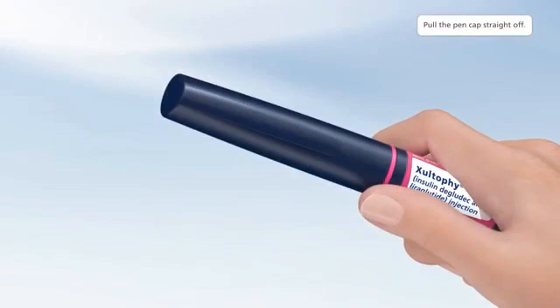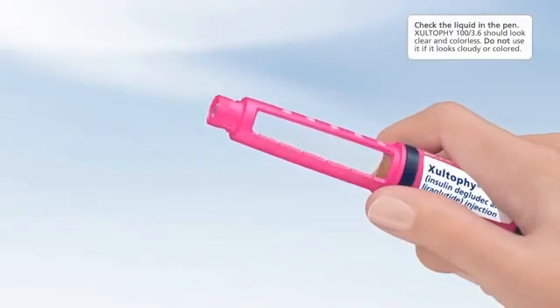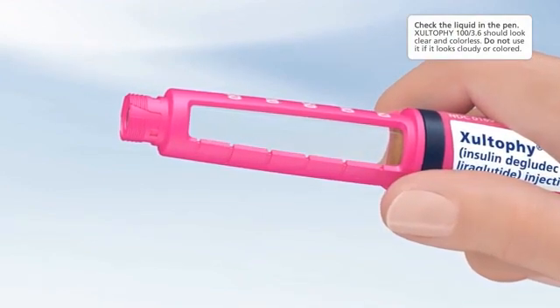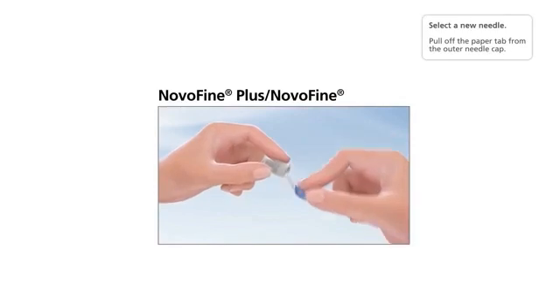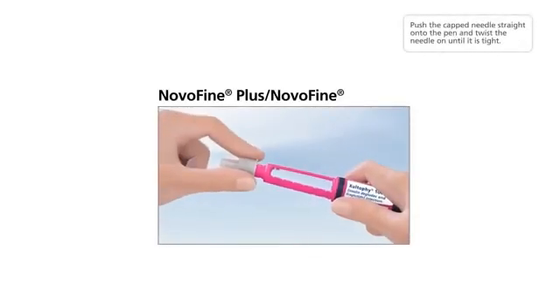Pull the pen cap straight off and check the liquid in the pen. Zultify 100 3.6 should look clear and colorless — do not use it if it looks cloudy or colored. Select a new needle, pull off the paper tab from the outer needle cap, then push the capped needle straight onto the pen and twist the needle on until it is tight.